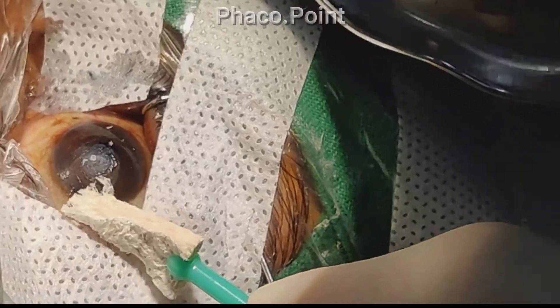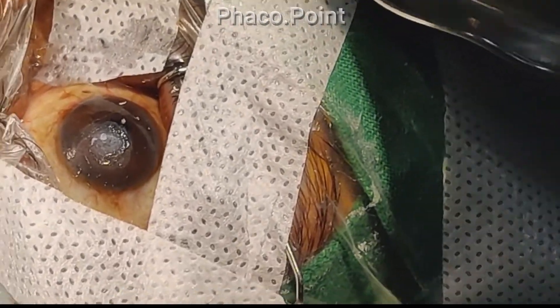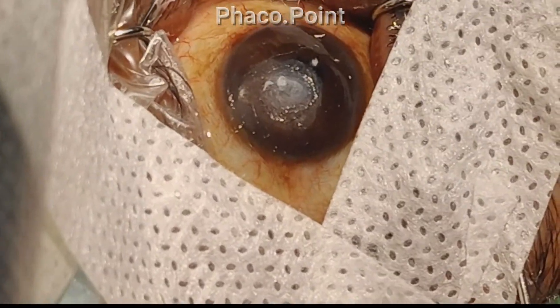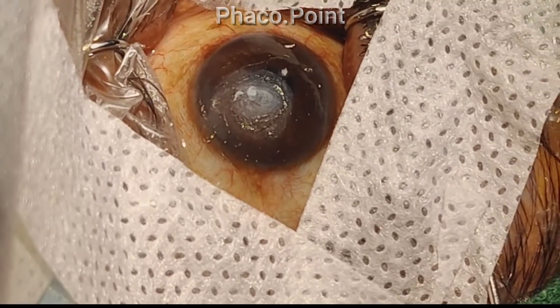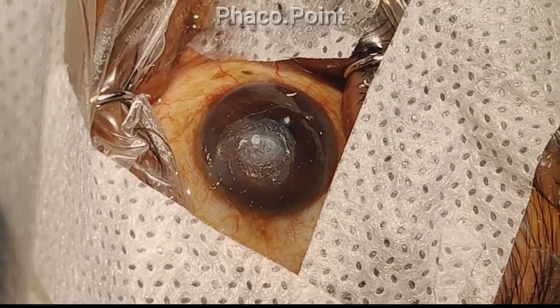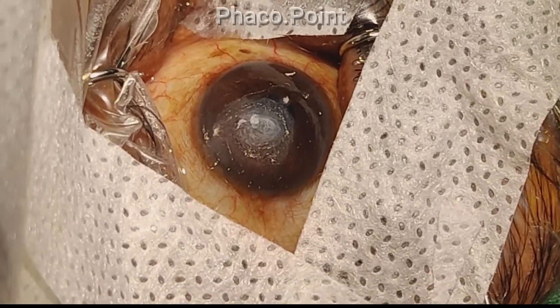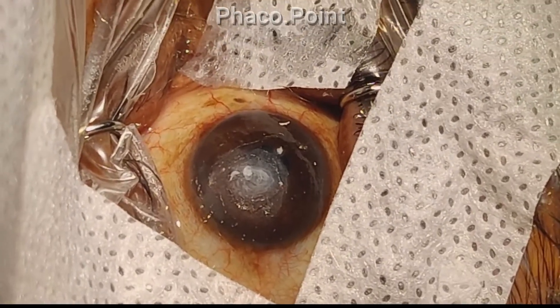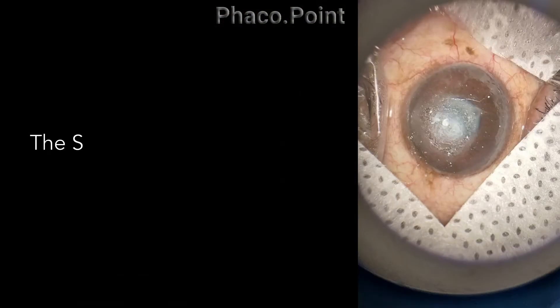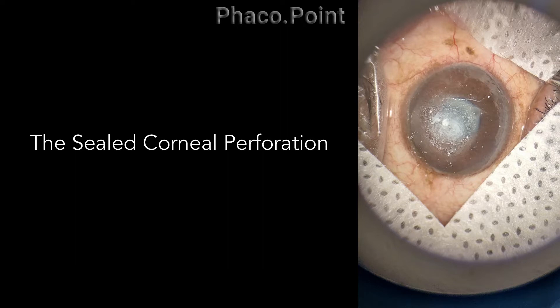Note how almost instantaneously the glue polymerizes, hardens, thickens and expands. Within a matter of a couple of minutes, you've got yourself a temporary seal for this corneal perforation. At the end of the polymerization, this is what the cornea looks like — the glue is now expanded, polymerized and hardened, and provides a perfect seal to the corneal perforation.